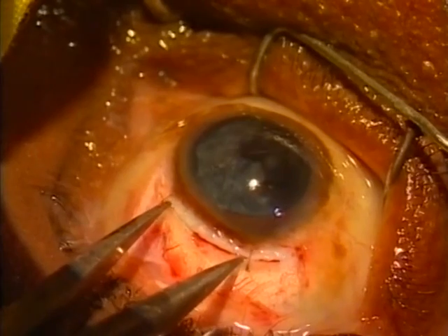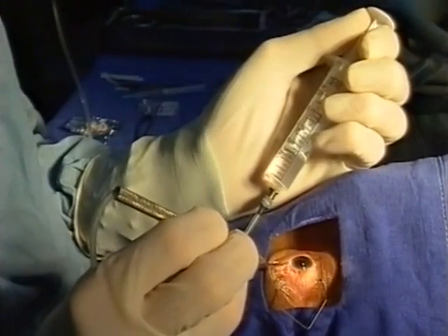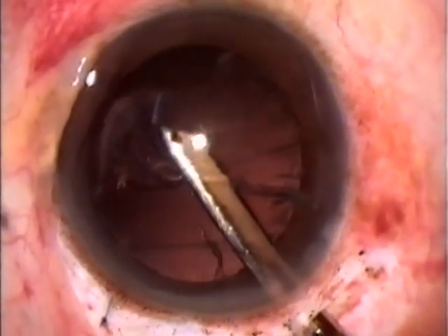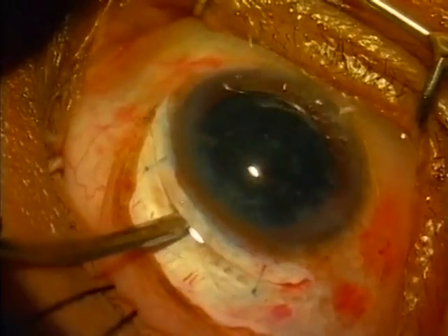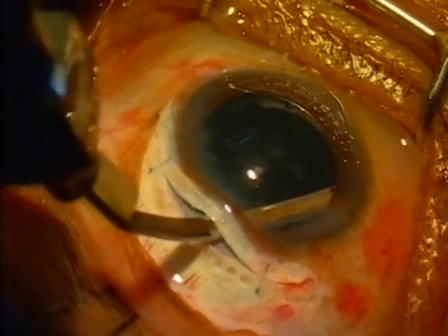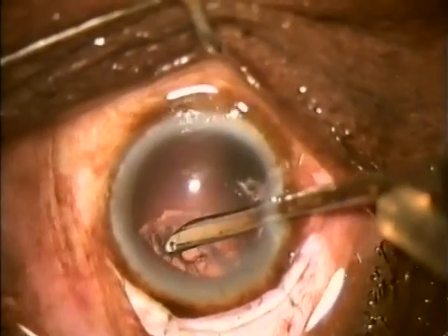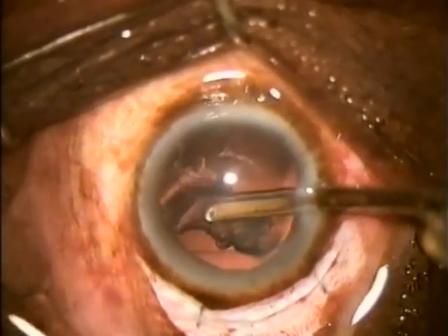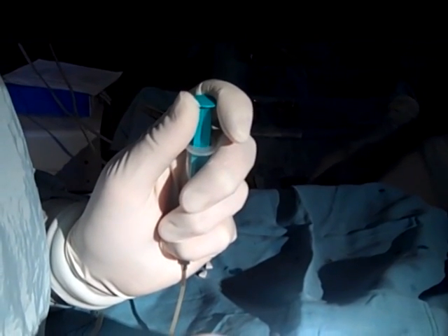Make sure to leave enough room to insert the lens and carry out further intraocular manipulation. A manual irrigating aspirating cannula is a reliable and inexpensive way of removing the remaining lens matter. The lens cortex is drawn into the aspirating port and can be removed from the eye. The aspiration port always points upwards, which reduces the risk of posterior capsule tears. Aspiration is carried out by applying gentle suction to the syringe between your thumb and forefinger.